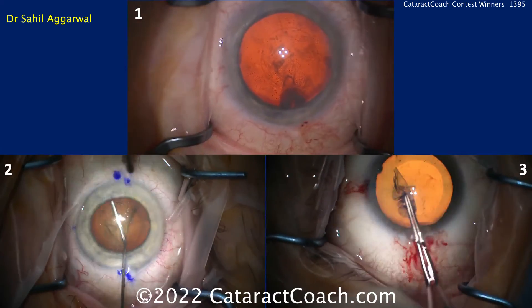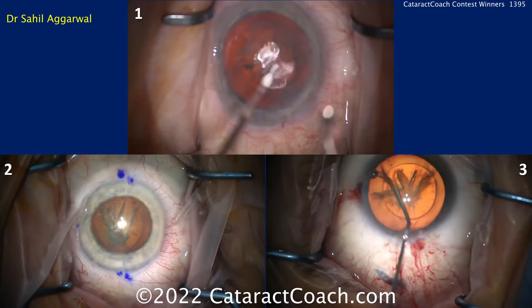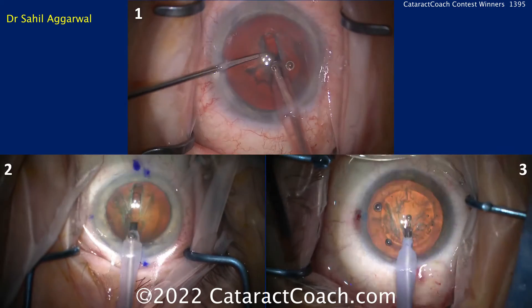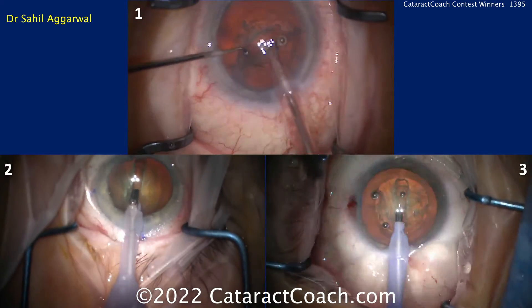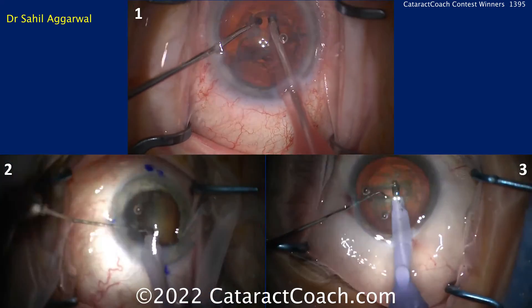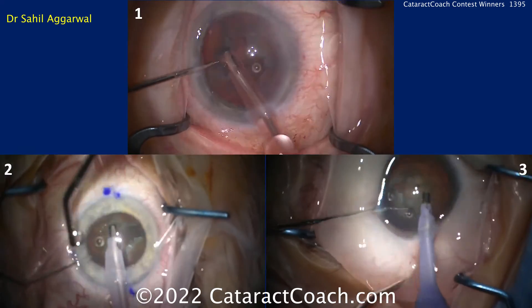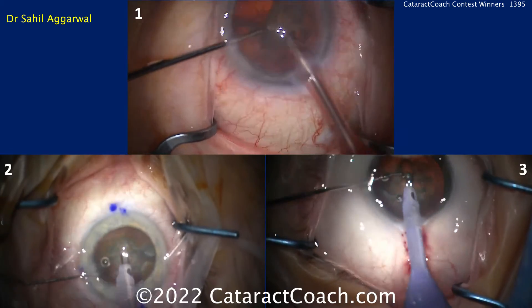I'm already starting on hydrodissection for panel two. For panel one, hydrodissection — used a special cannula. For panel three, I'm having a little bit of a hard time with the hydrodissection, but eventually the lens does come up a little bit. Starting phaco for all three cases now. I'm doing a pretty standard divide and conquer technique for panel two and panel three. For panel one, I'm also starting with divide and conquer and doing a little bit of chopping as well. Using a Conner instrument for panels one and three and a Drysdale instrument for panel two.